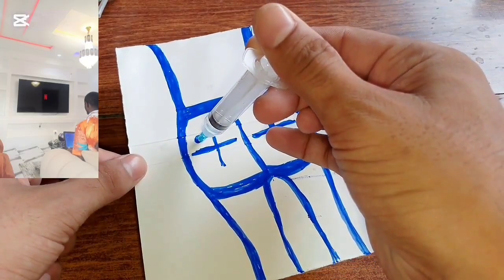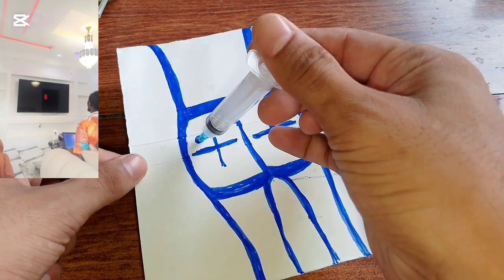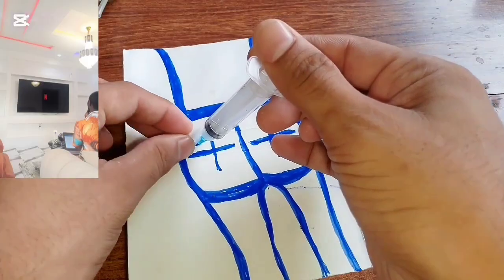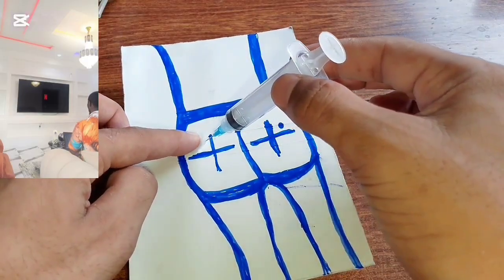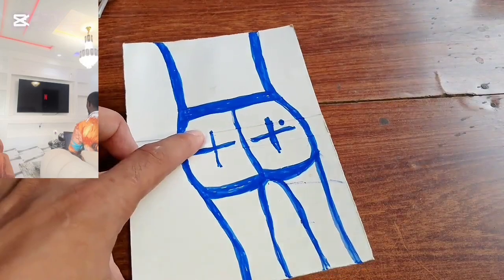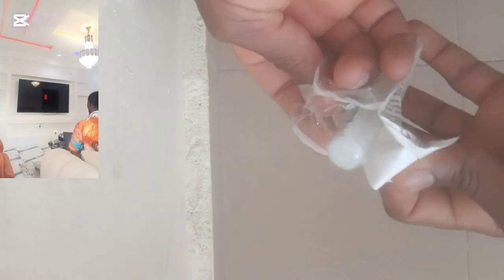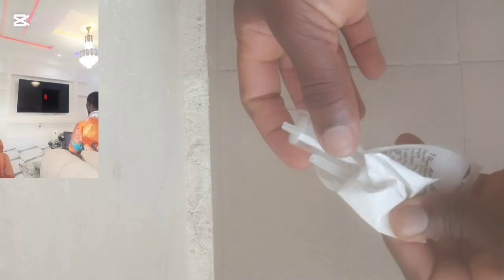It is the upper outer quadrant. The reason why is because there are not much nerve endings there, I mean the sciatic nerve. But in this video, if you watch carefully, you will see there was no ensuring that the tip of this syringe doesn't touch the paper because it could get contaminated.